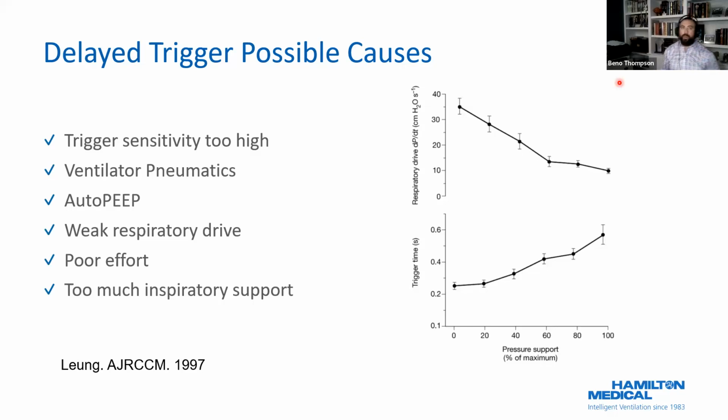Weak respiratory drive, obviously. Poor effort, that goes in the same bucket. And then the last one, too much inspiratory support. So this is where this chart comes in.